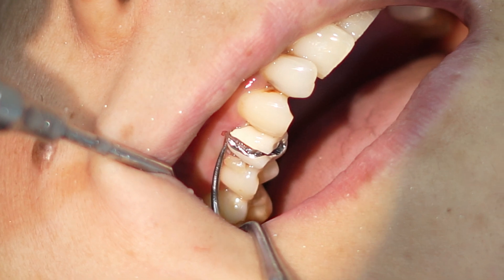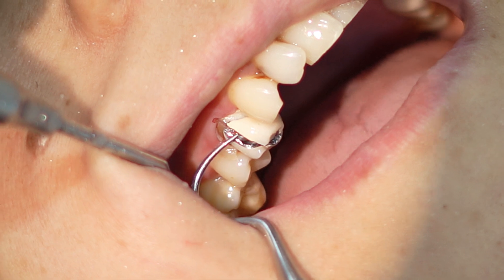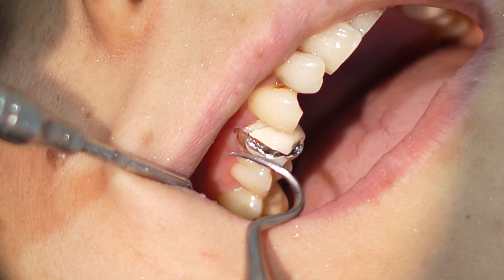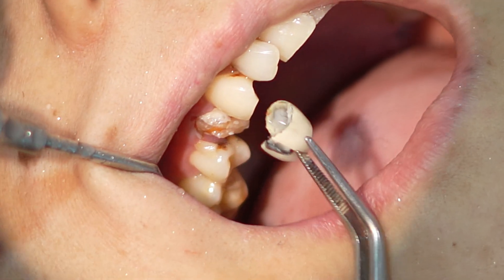I took a couple of radiographs and decided to remove the crown. I cut the crown at the center with the help of carbide burs, and removed the crown with an instrument. The reason for not saving the crown is that, as I already mentioned, the crown is faulty, so it is better to replace it. The crown was removed before starting any other procedure.